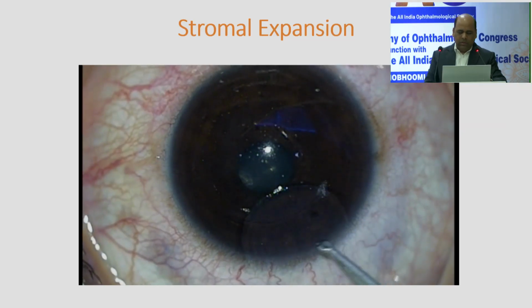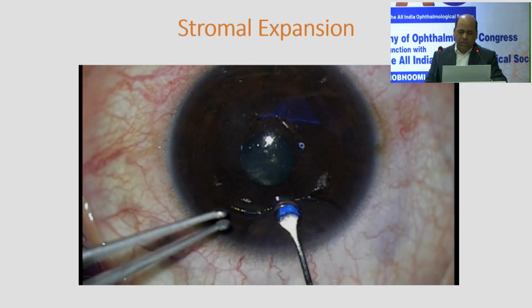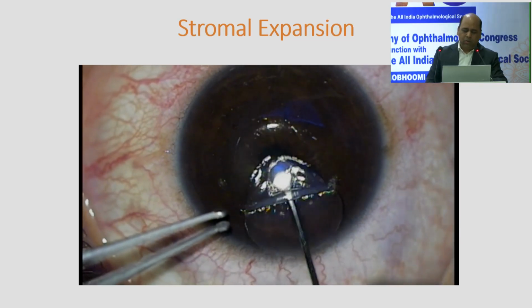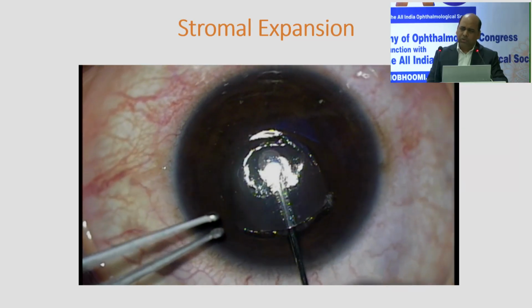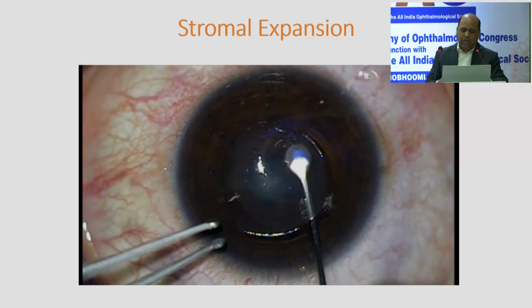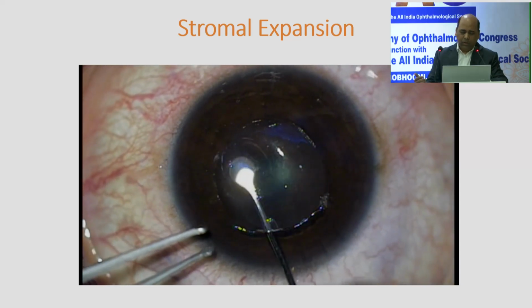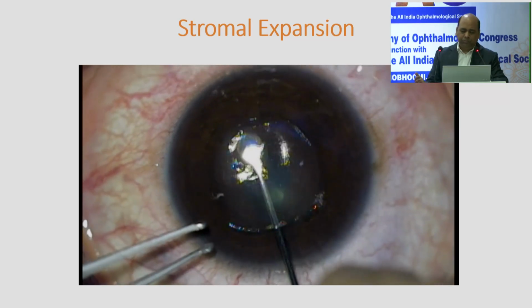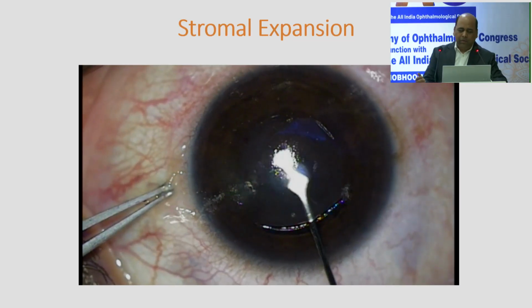And this is the donor lenticule, a donor SMILE lenticule from the patient. Usually I prefer to use at least 120 or 130 micron donor tissue, and simply you have to push it inside. The procedure is very simple. There is no learning curve. You have to push up to the extreme opposite end. It should not come in the wound. Once you make sure that it is nicely settled, unfold it, and the procedure is done. So you have added the tissue.